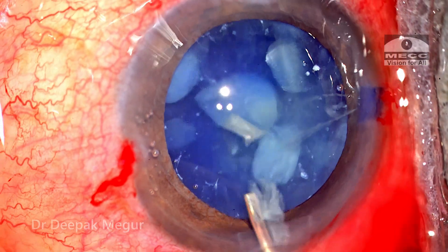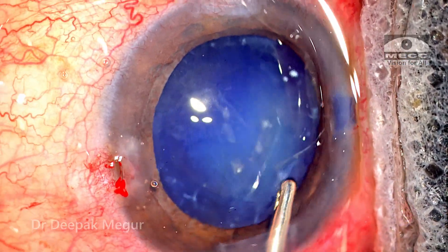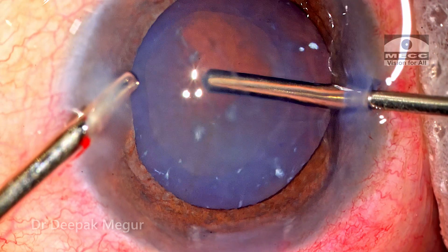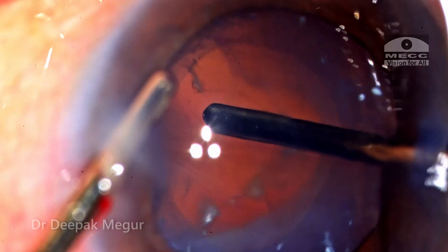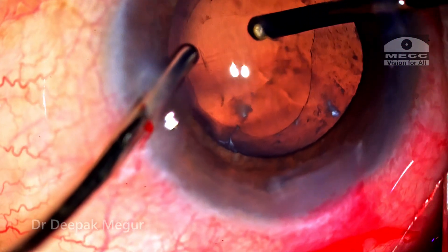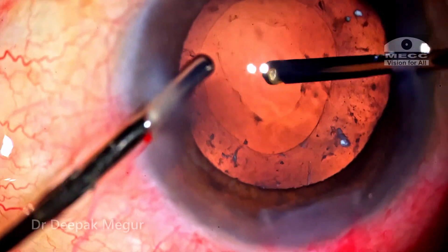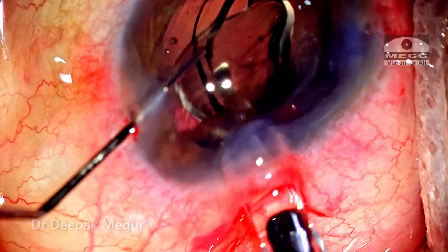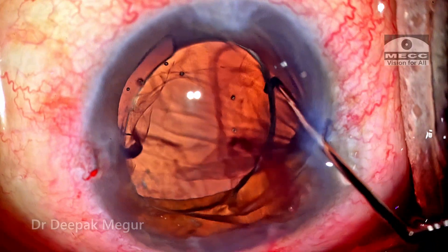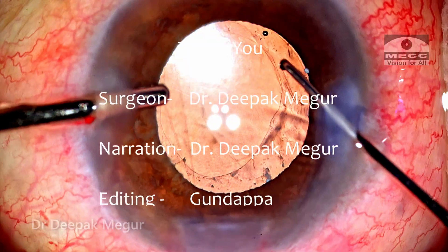To summarize: there is always a possibility that lens matter can percolate behind the posterior capsule into the Berger's space and vitreous cavity, and it can be dealt with in the same surgical setting. Using the vitrector to perform the posterior capsule rhexis can be helpful in situations where the red glow is absent, visualization is compromised, and the bag is not so healthy. In retrospect, if I had a second chance, I would consider implanting the lens first and then performing the posterior capsule rhexis with the vitrector followed by vitrectomy — because maneuvering the lens through a soft post-vitrectomized eye is challenging, and implanting the lens first would have probably avoided that difficulty.